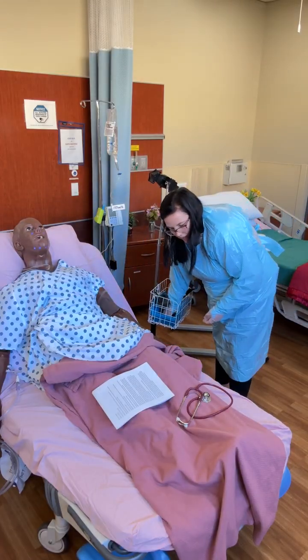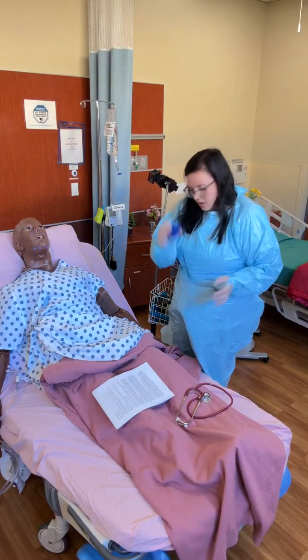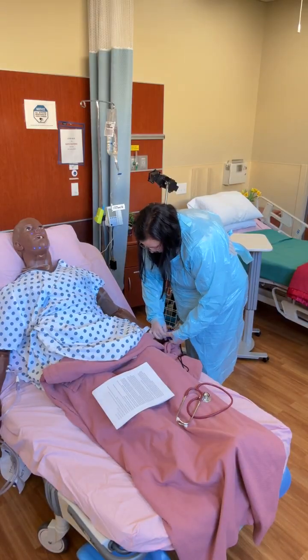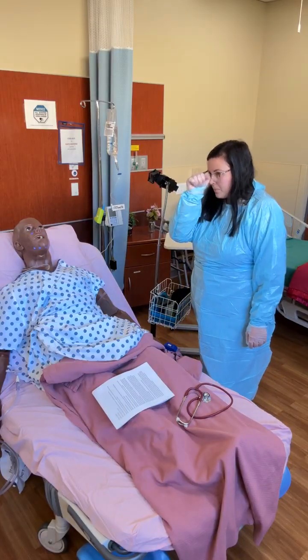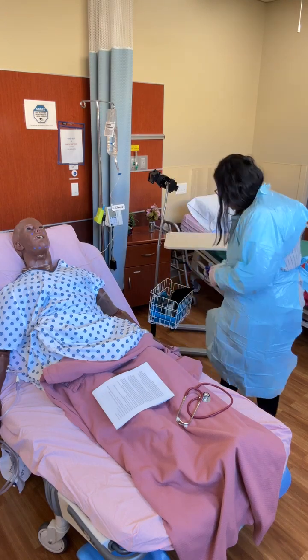Alrighty, and then we have the pulse oximeter right here. We're putting that on our patient's finger. Stan, I'm just going to put this on your finger. And sim question, what's my SpO2? Your SpO2 is 92%. 92%. Someone writes that there for me.